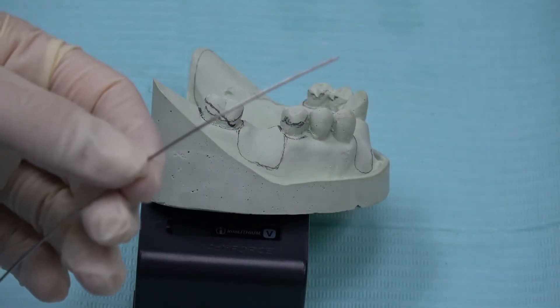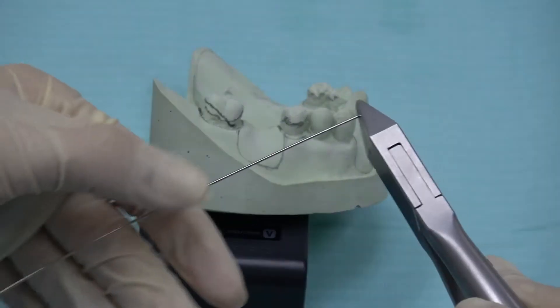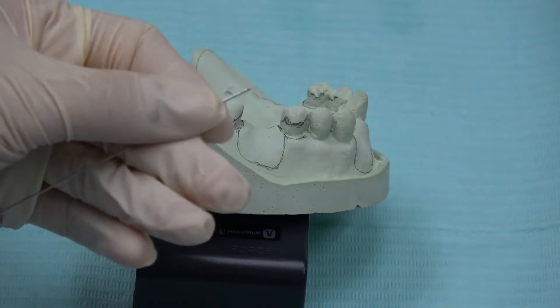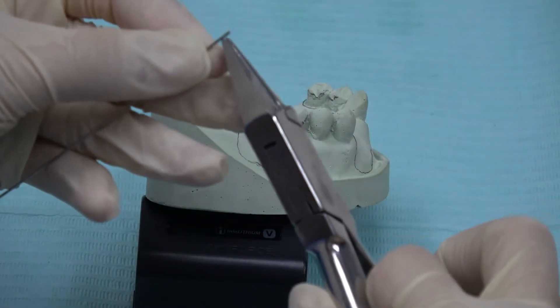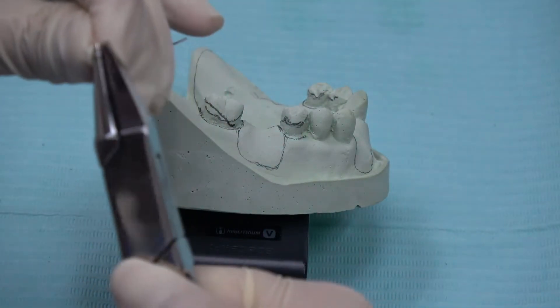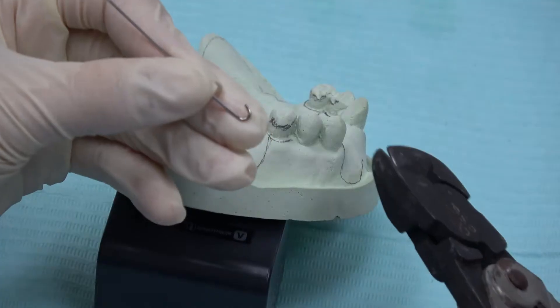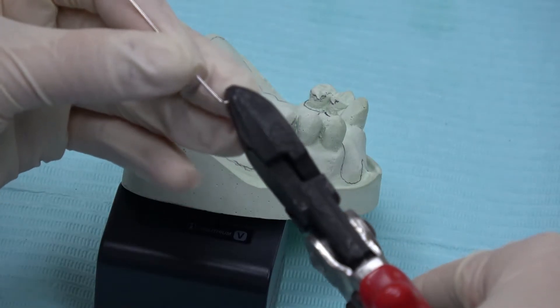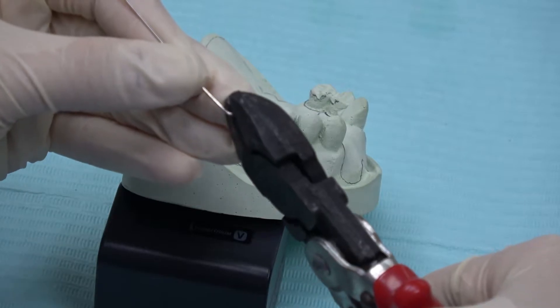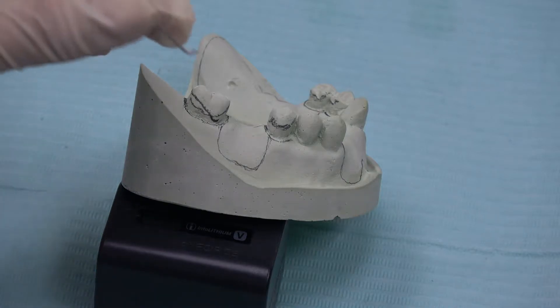First, I am going to straighten the wire with Adam's plier. Bend the tips of the clasp with spring form plier. Now, cut the tips of the clasp to get the C shape. Make sure when you cut the wire, it should face the floor.